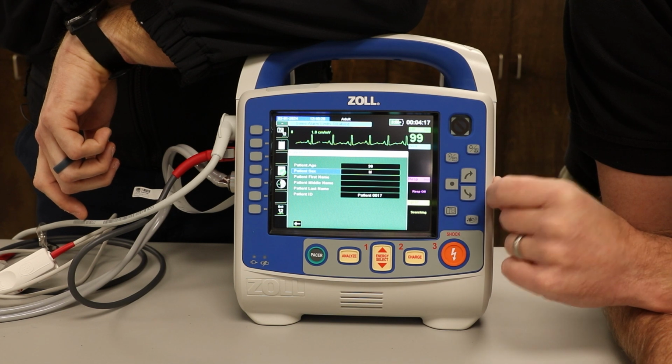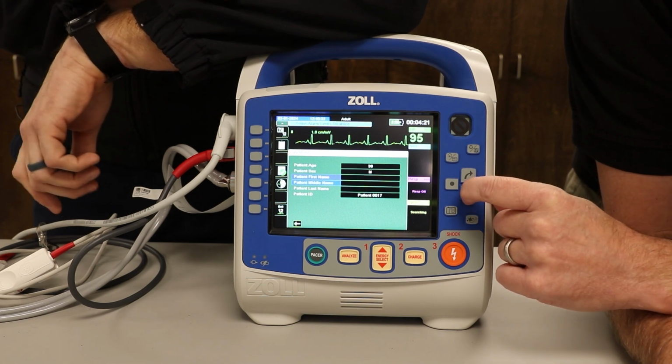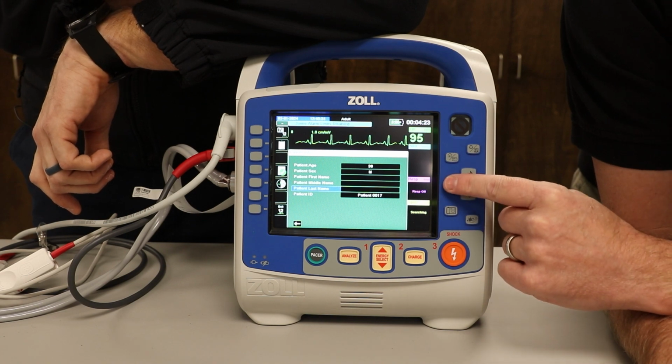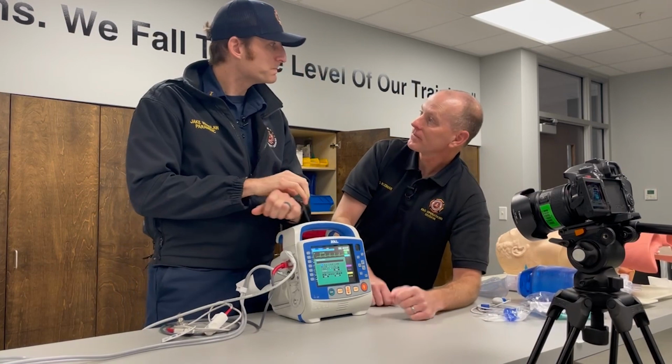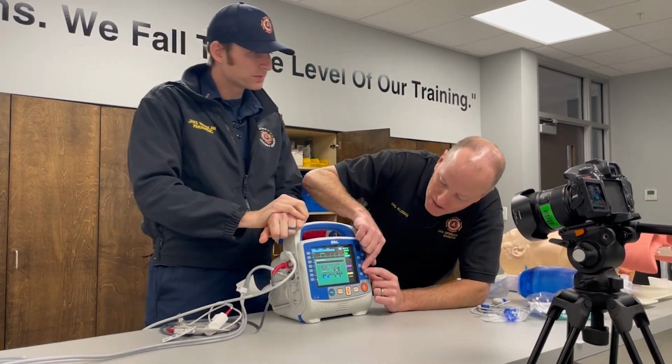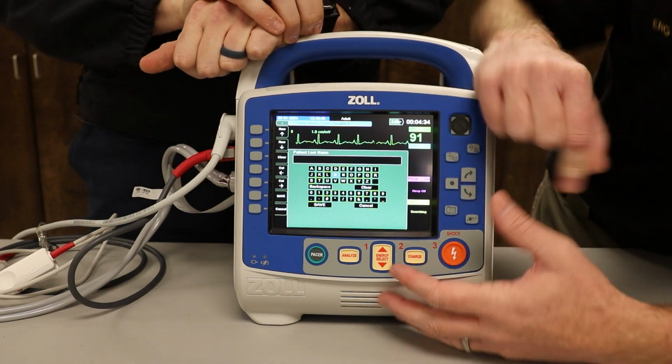Okay. You have to be male. Correct. We don't have to worry about first name or middle name, but last name. So we're going to come in here. Now this is where people lose it. Because if I click these buttons, I'm just going to keep going around and around, and I can get to a W. Oh, what a pain. Yep.